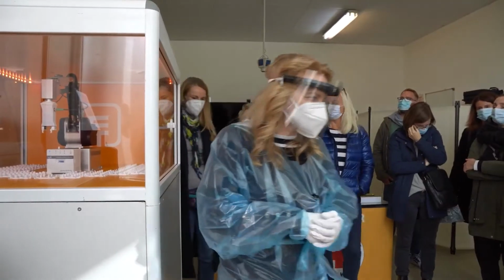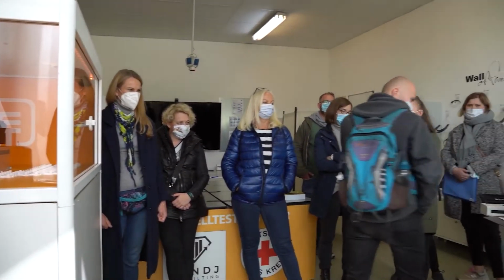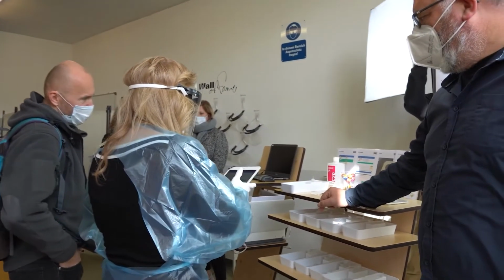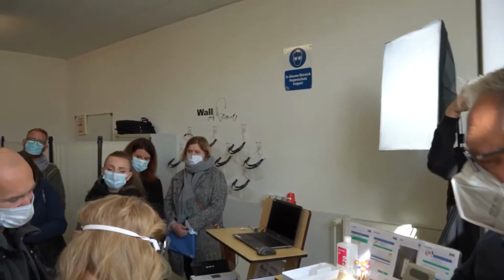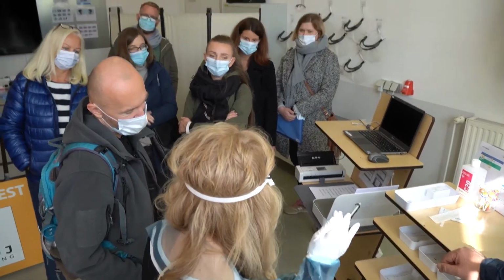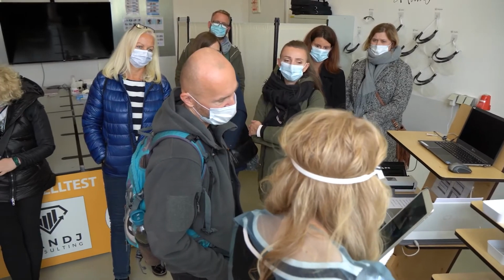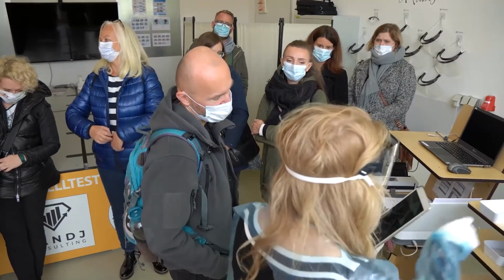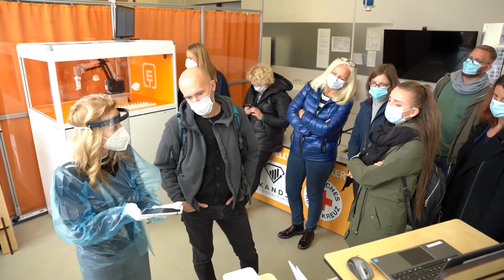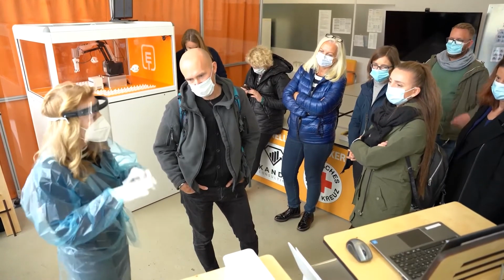Okay. Maybe I can explain a little bit how the software is built, because it's very easy. You work with tabs. And you have seen I was making a check-in. I have a camera. I have to read the code. I have to validate it and say, okay, the person is here. I have to scan the test together, and that's all. It's finished. The work is very, very easy. So with 2 scans, you make a complete test.